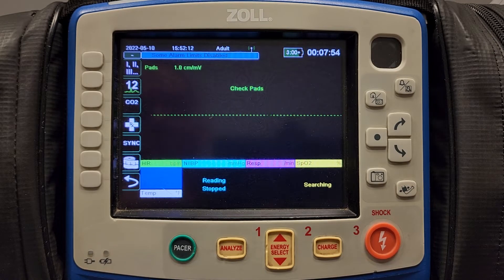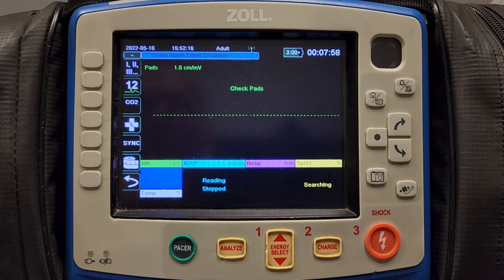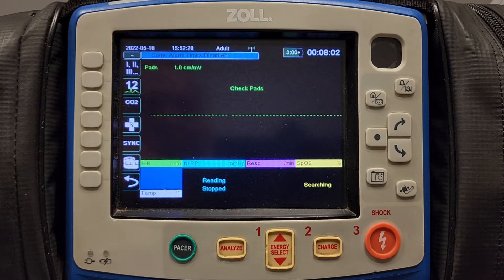This video will show you how to upload vital signs from the monitor to the Zoll Cloud, and also how to upload or download vital signs from the Zoll Cloud into your charting software.